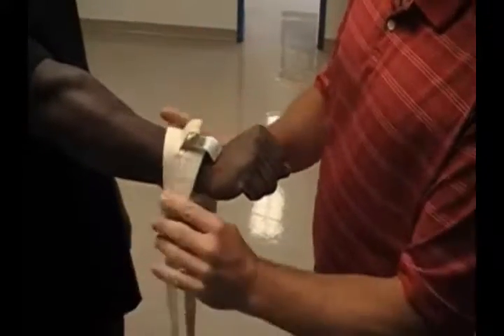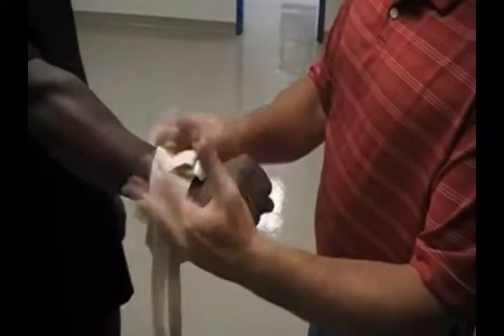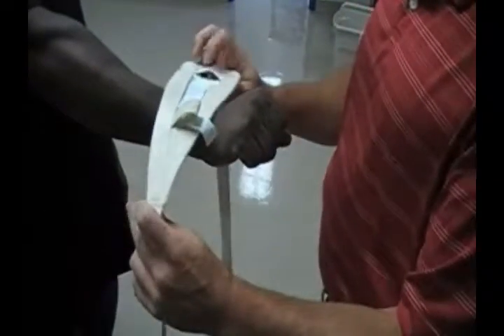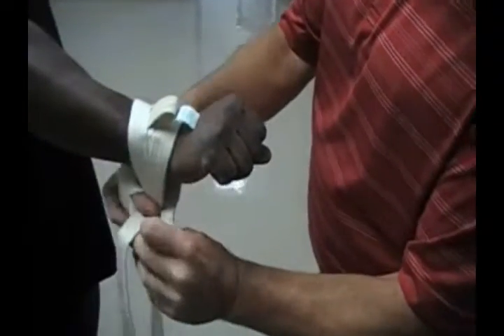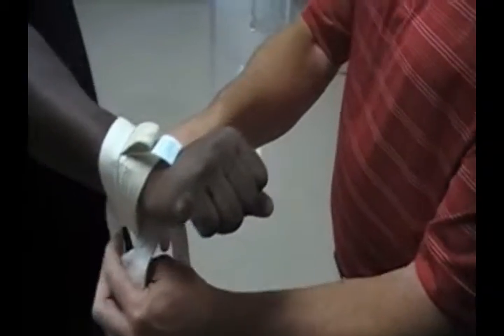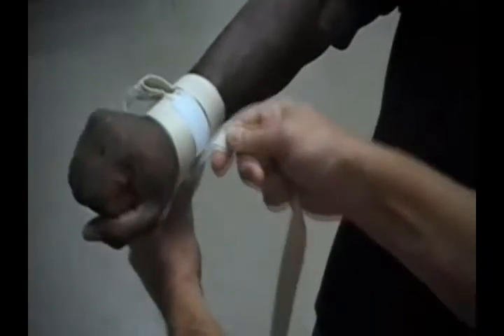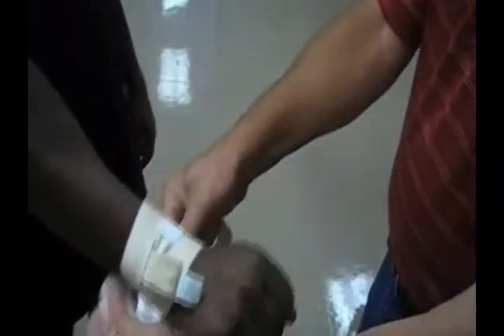When you're applying it to the patient, make sure there's nothing on the skin — no shirt, jewelry, or anything like that, so everything is clear. Putting the thick side on, whichever way you're comfortable. I'm going to put my finger through it so as I come over to this side, I can grab the strap and pull it straight through. On this side it has Velcro. You need to connect this Velcro, but you don't want it super tight where blood can't flow through, and you don't want it super loose. You want it just taut.